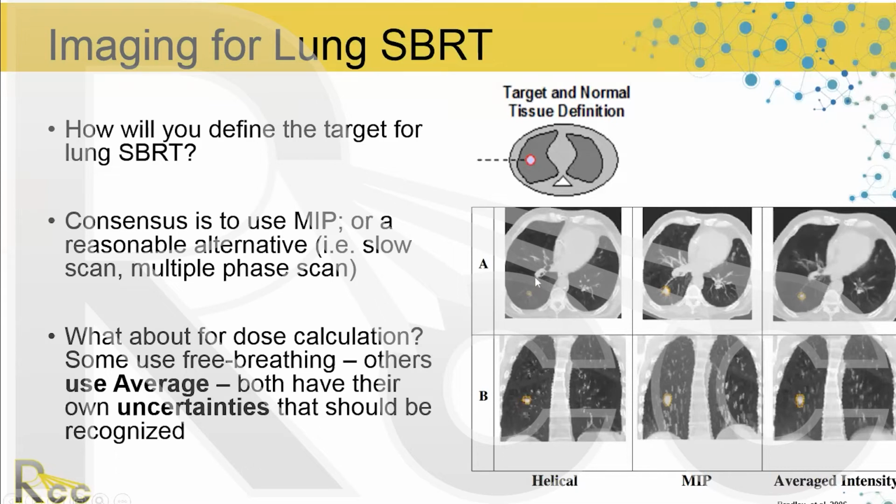In the liver tumor, it's the opposite. The tumor actually shows up with less density than the liver tissue. So using the minimum intensity projection allows you to get a better visualization of the liver malignancy. So it's just about the tissue type and the contrast.